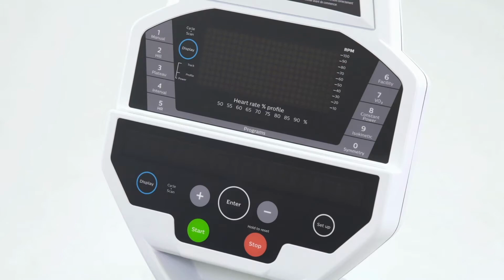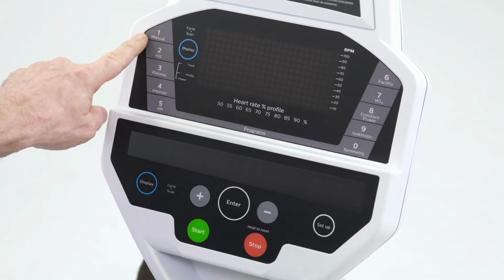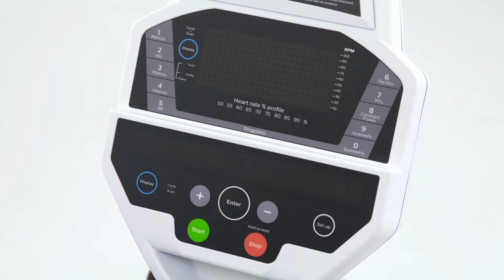We have a VO2 test. It's the YMCA protocol submax VO2 test. A facility program allows you to build your own protocols and profiles and save them there. And then on the left side, we have a few exercise programs: a hill, a plateau and interval, and then a heart rate control program. So that is the basic functions for the bike from the console standpoint.